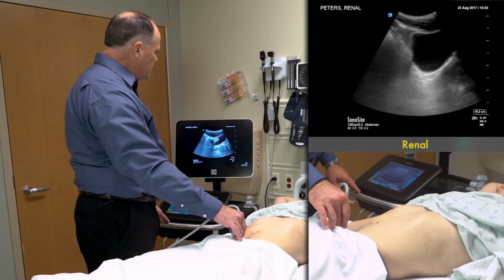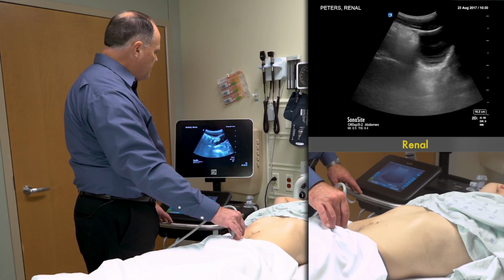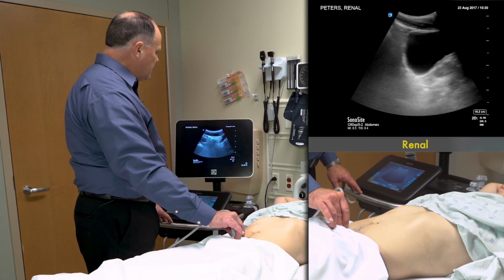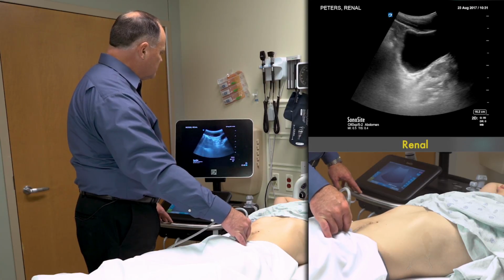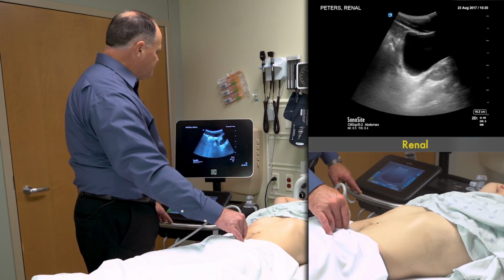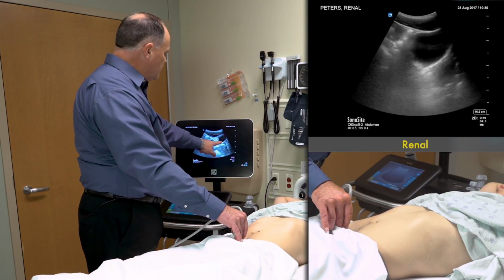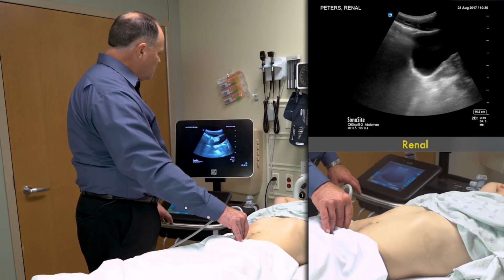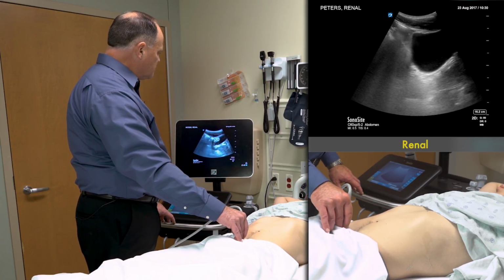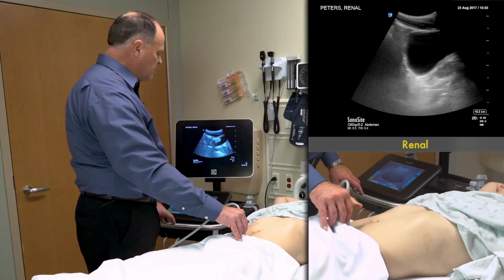And once I'm ever imaging the bladder, whether it's renal ultrasound or a FAST exam, I fan in the long axis from side to side so I can see the entire bladder in long axis. Okay. Many times, if there's a large stone, I'll see it entering the posterior aspect of the bladder, and it will look like a calcified structure that's giving us a clean, high attenuation shadow just below the calcification.